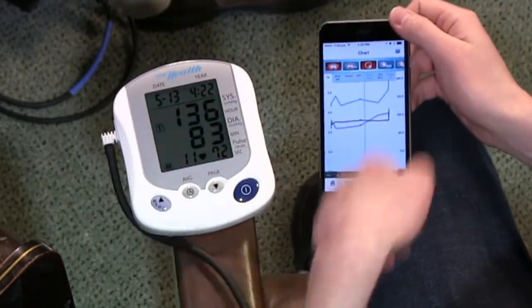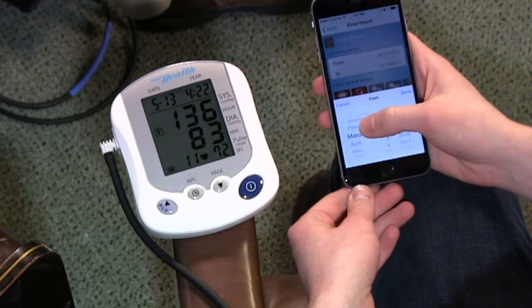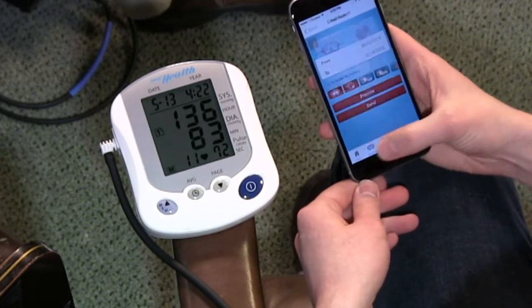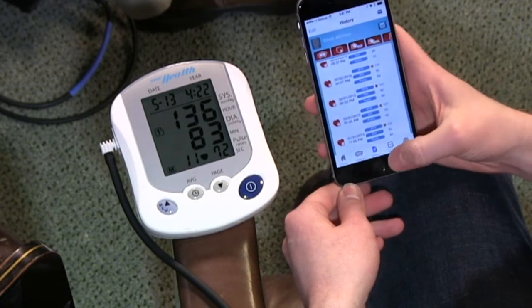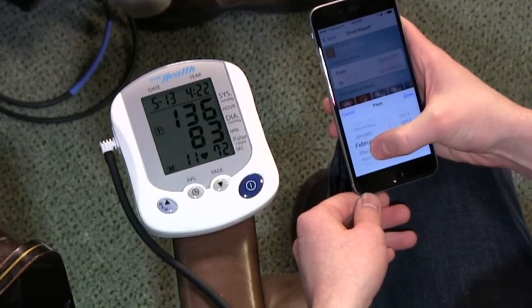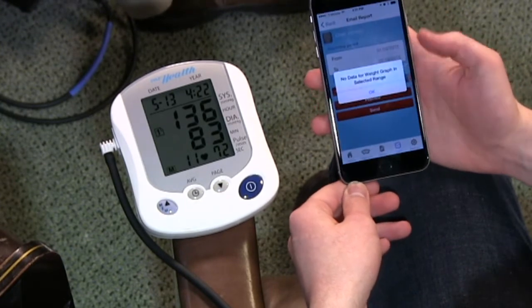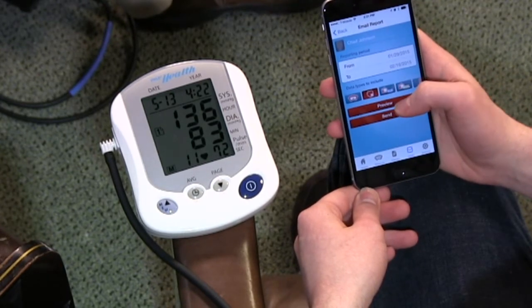Back on the app though, you can do a few things, like you can email this to someone. I forget when it started. Where did I start my measurements? I started, oh, January 31st. Okay. So if I go back to charts, I can email this. I can choose. So that's nice. And again, the doctor really loves to see this, because your blood pressure's higher when you wake up. It's higher after you have a cup of coffee. You want to see it over the day and over a few days and weeks, so you get a sense of how soon Chad's going to have a heart attack. Right, or stroke. Exactly.